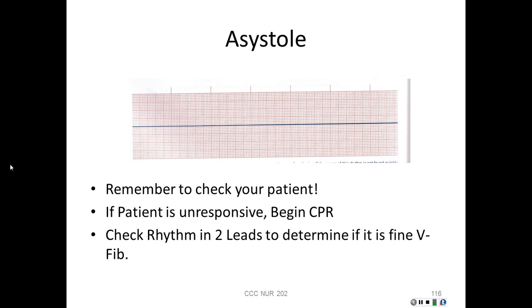Asystole, of course, everybody knows asystole is the absence of a heartbeat. With this patient, there is no mechanical or electrical activity going on with his heart. If you see this going across your monitor, always remember to check your patient. It could be as simple as a lead off. If your patient's unresponsive, begin CPR, call the code, bring the crash cart in. Once you get them hooked up to the crash cart, you need to check that rhythm in 2 leads to make sure it's asystole and not a fine V fib. We do not shock asystole. Again, we do not shock asystole. There is no electrical activity to shock at that point.